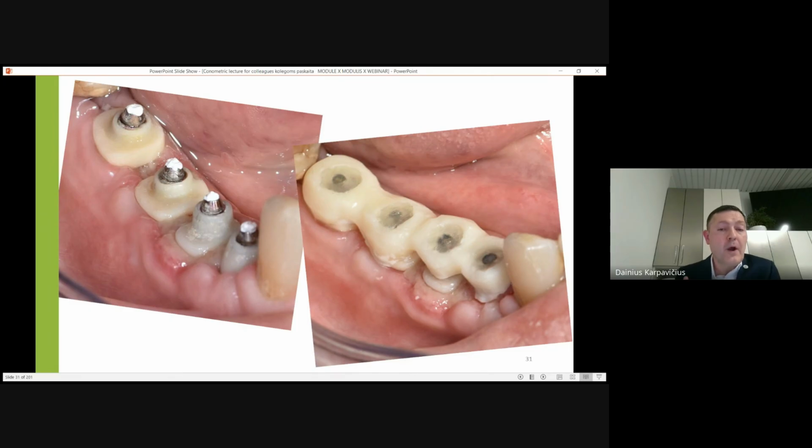No matter what the primary stability of the implant is, predicting the influence of the tongue is very difficult, because the tongue is moving around these accessories 24/7 without stops.